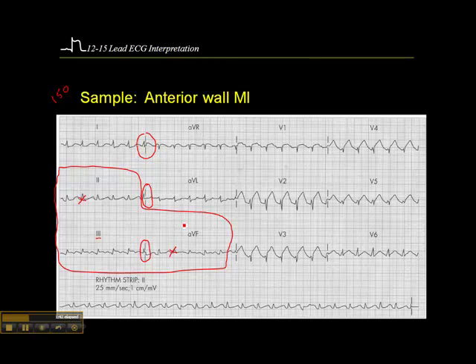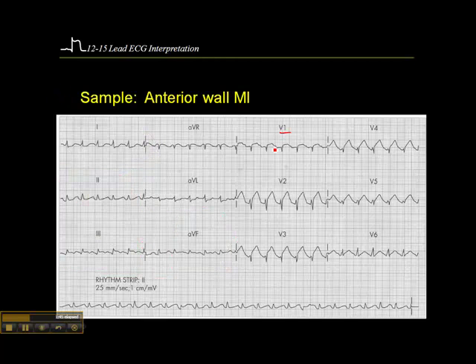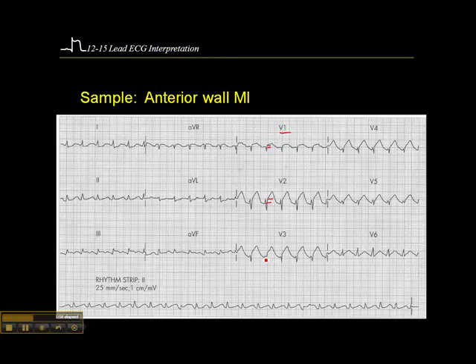Then we'll look at the anterior leads. If we look at V1, there's just a little bit of ST elevation there, probably about a millimeter. V2 — here's the baseline, there's a J-point — definitely at least a couple of millimeters of ST elevation. V3 — here's the baseline, there's a J-point. V4 — here's the baseline, here is the J-point. So clearly we have not just an anterior wall MI here, but we have an anterior lateral wall infarct.